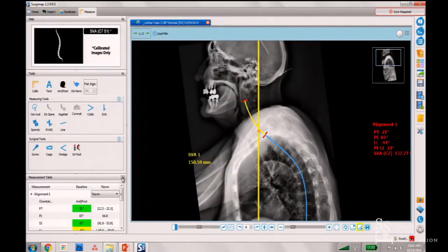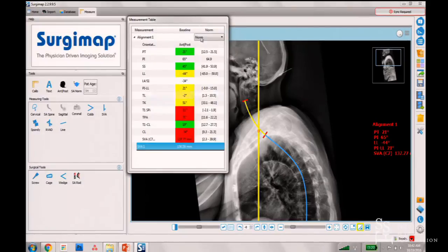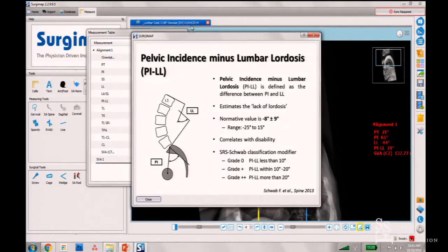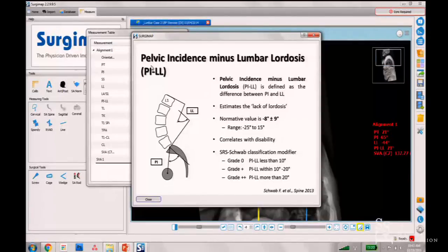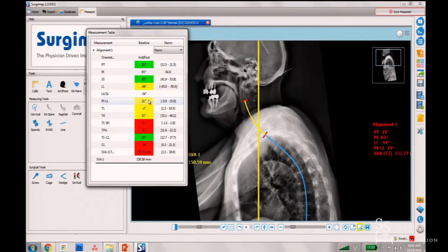The second key parameter is the shape of the lordosis. We don't measure lordosis by itself because 40 degrees can be perfect for one patient, flat back for another, and overcorrection for a third. The amount of lumbar lordosis depends on the shape of the pelvis. That's why instead of measuring each separately, we measure the offset between them — the PI-LL mismatch. You want those two parameters to match, or at least be within 10 degrees. This patient has a 20-degree offset, meaning the lordosis is short of the pelvic incidence by about 20 degrees.